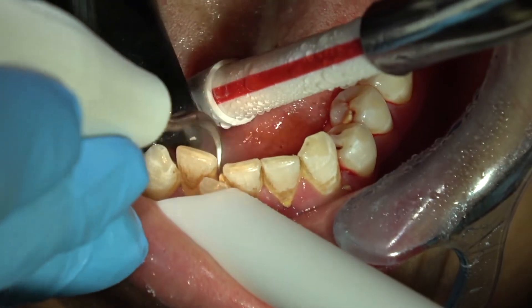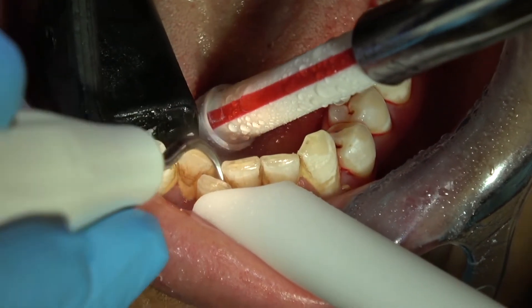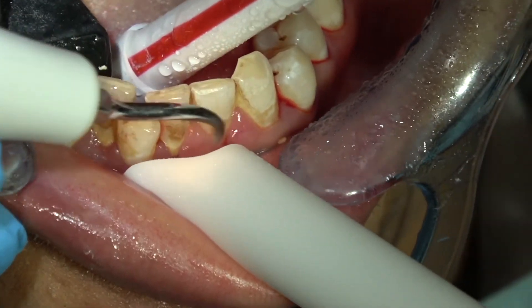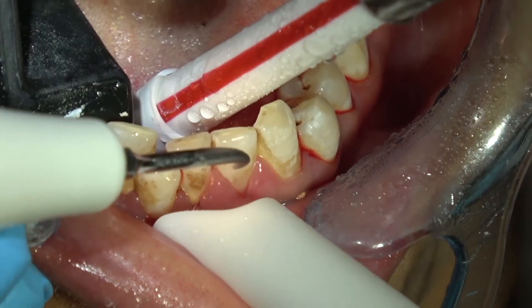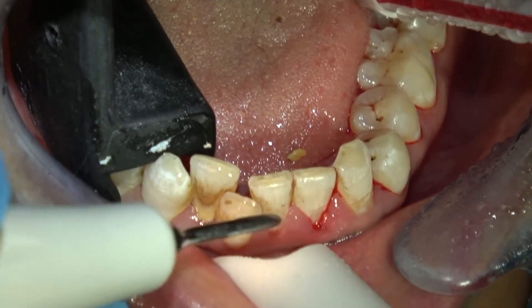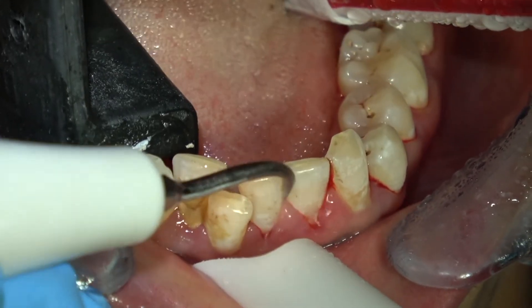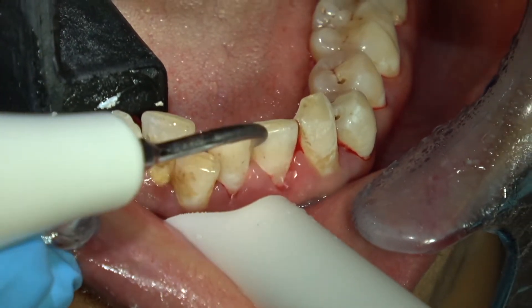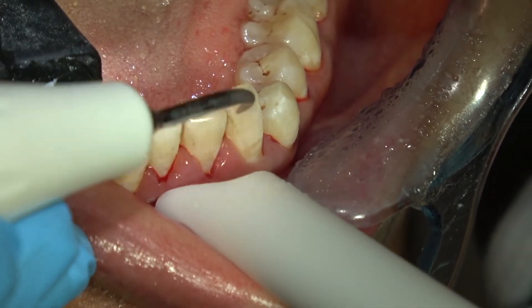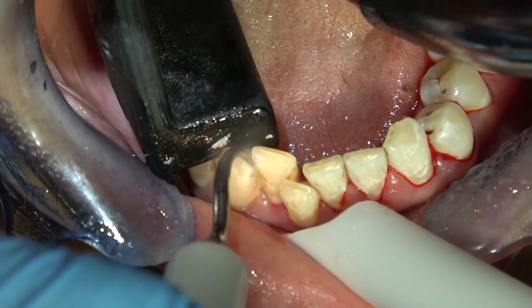We do the entire mouth at one time. Some say they've had it done one quadrant at a time, but I'm not sure why you wouldn't go ahead and do everything at once — though you'll probably want to use sedation. I'm removing the calculus, plaque, and most of the stain, and my hygienist will follow up and remove any last little bits of stain on the surface of the teeth.